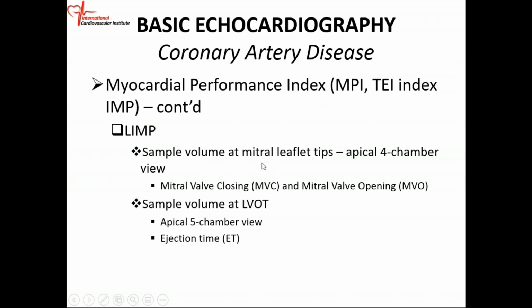So what we do, we put the sample volume at the mitral leaflet tips in the apical four-chamber view, and we're going to look at mitral valve closure and mitral valve opening. Okay, and so the important thing about LIMP is to know the definition.